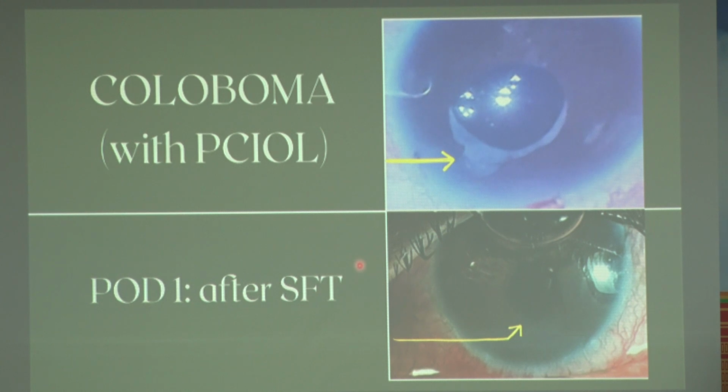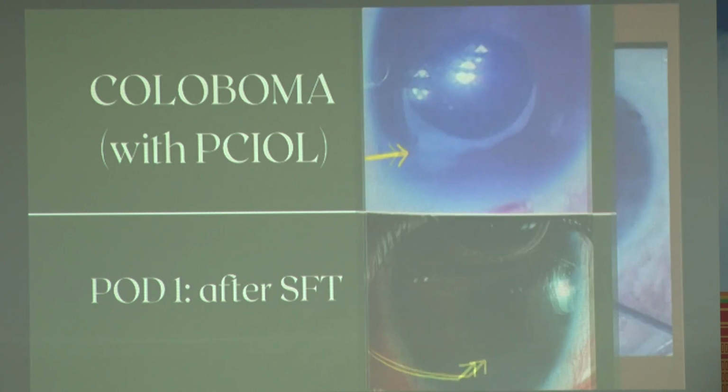This is another case with coloboma, and this is the pupil size, and this is the colobomatous zone, and this is the first post-op day. The pupil is relatively centered and the size has also decreased.